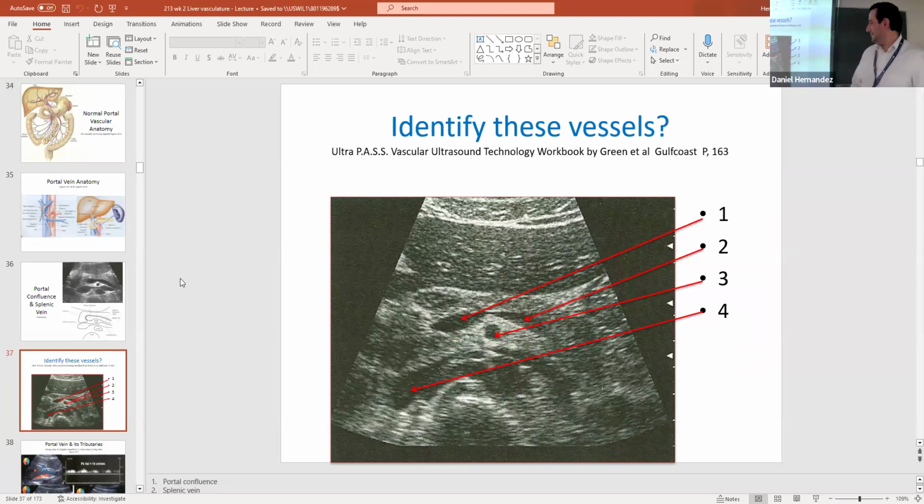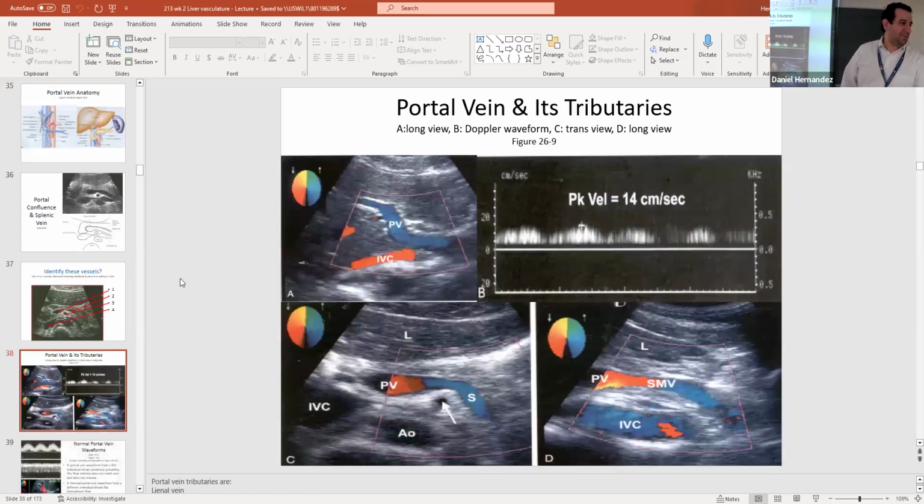Mostly not. I'm going to have a hard time scanning this. Yeah, me too. It's all brand new to you. I know. I still can't remember the indicator. I think going past some consoles, putting it at 3 o'clock.